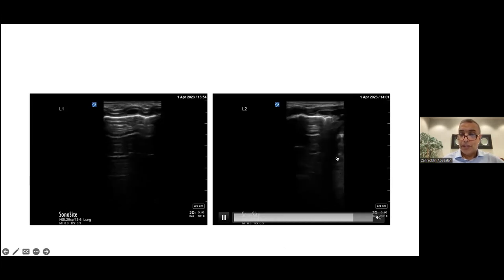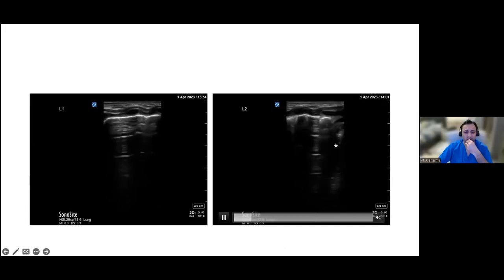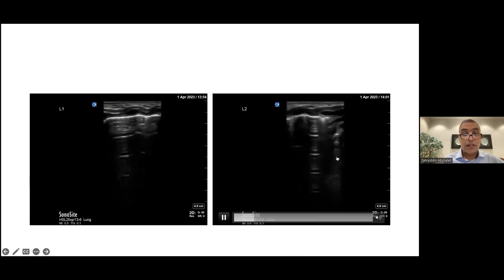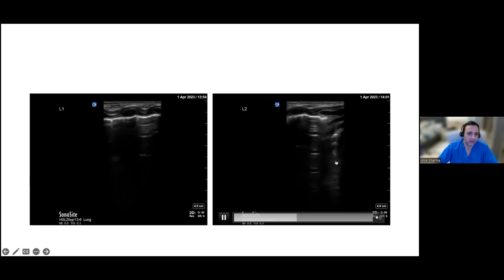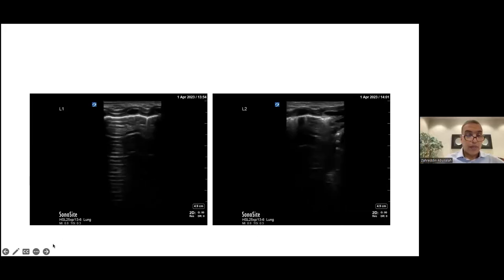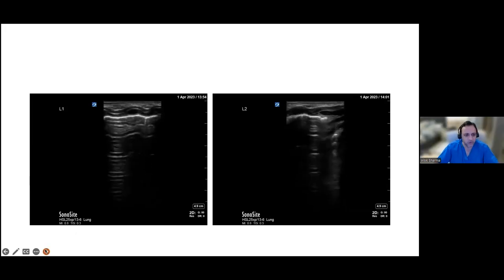And I'm not sure if this is the diaphragm, though, where my... Is that the heart? It's not the heart, is it? Probably. It looks like, yes. It would kind of be where the heart would come in. It could be the diaphragm as well with the spleen. It could be because you're in the lower zone, but I would agree that L1 and L2 look normal. Yeah. We'll go through all your images and then we'll talk a little bit about maybe image optimization, but let's go through everything. Yeah.